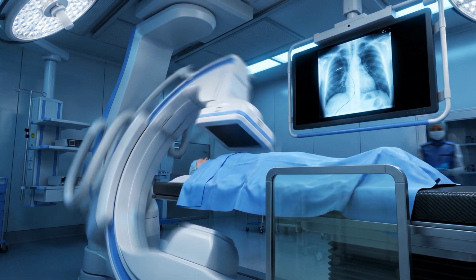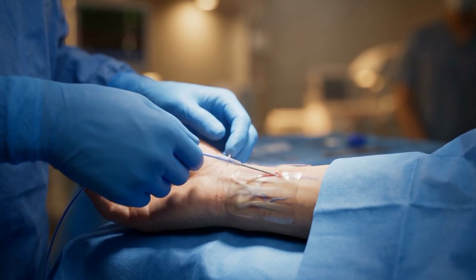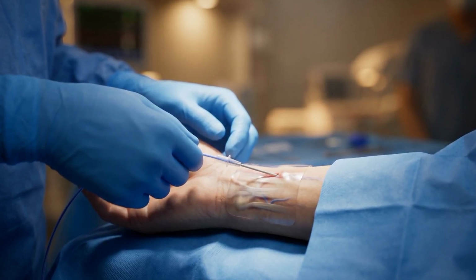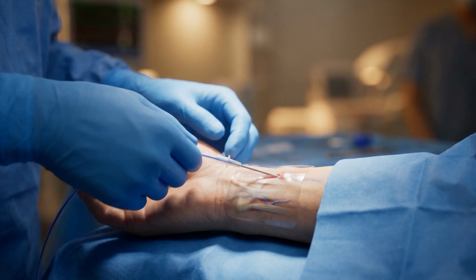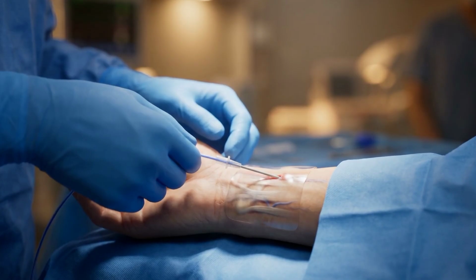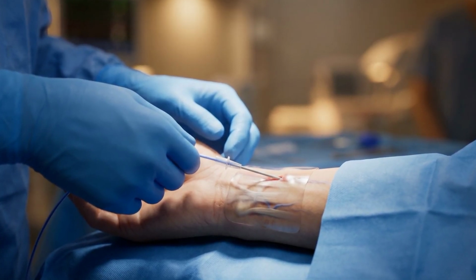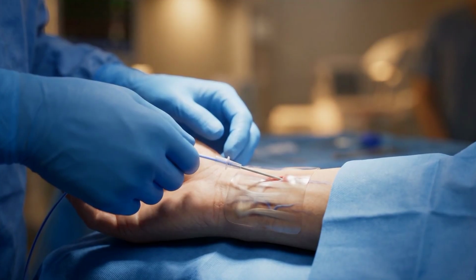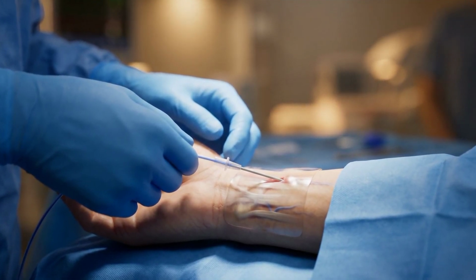If any of your family members or friends have faced a heart problem, they would have said, we have undergone an angiography. See, here they are inserting the catheter. This is what I said. Now, if they find a blockage, treatment can be done immediately, on that same table itself. This is called angioplasty. Angiography is identifying the block. Angioplasty is the treatment.